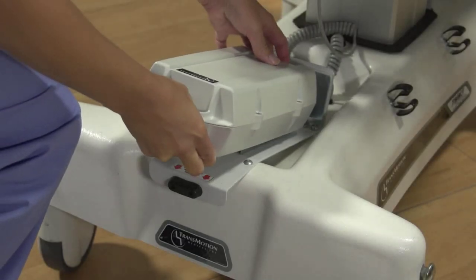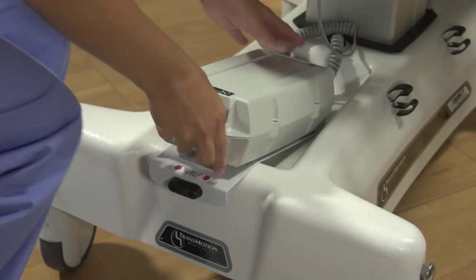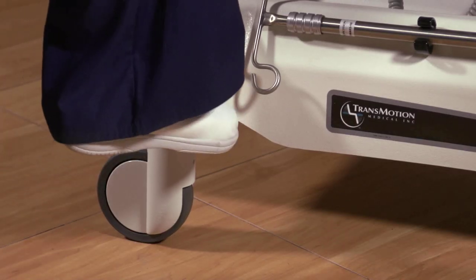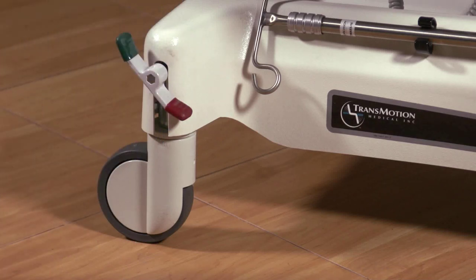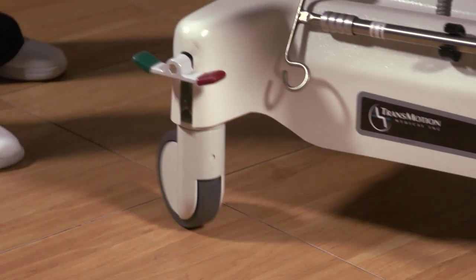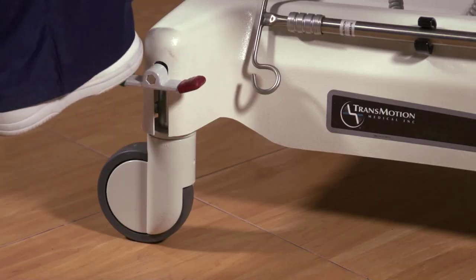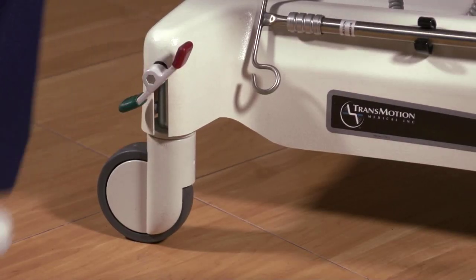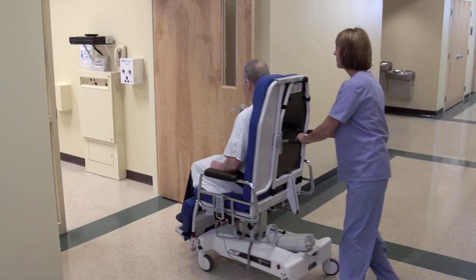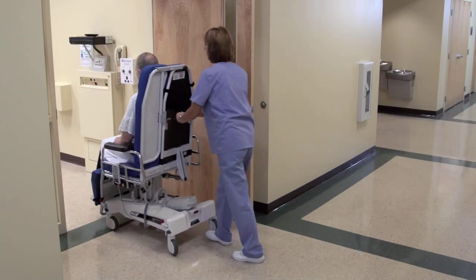Place the fully charged battery back onto the chair. The four-wheel brake and caster system makes steering and stopping easy. Remember, red means stop and green means go. When you push the red brake lever down, you lock all of the casters. When the brake is in the level position, all four wheels rotate freely. And when you push the green lever down, you lock the right front caster only, letting the other wheels trail for optimum control while you transport the patient.